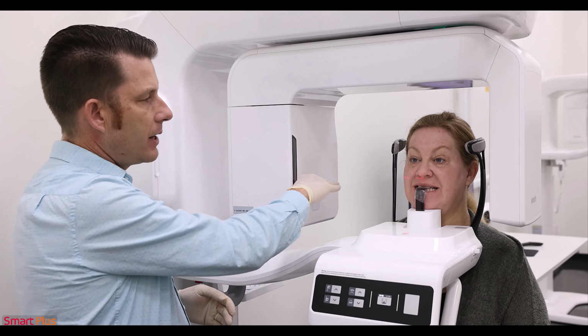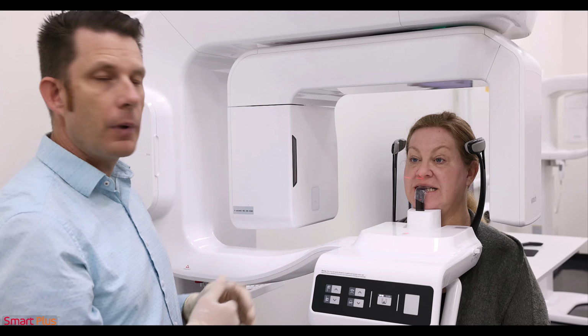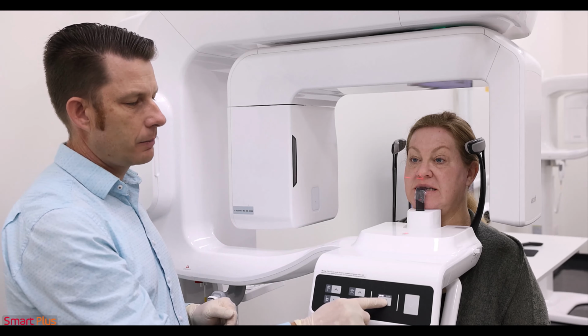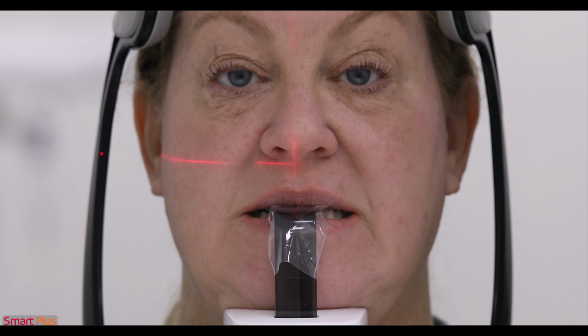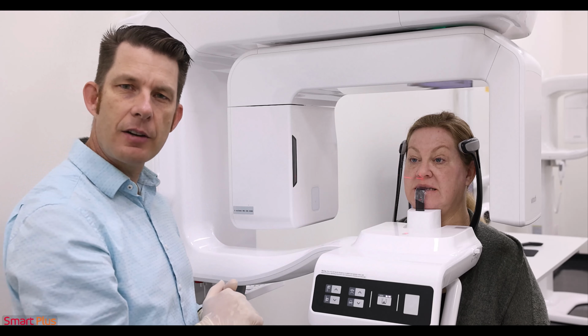We also have a red positioning beam shining on the right side of the patient. I use that as a reference to ensure that that occlusion is flat or parallel with the floor. Once our patient has been positioned, I'm going to go ahead and close our temple supports. Ensure that the patient is lined up center still.